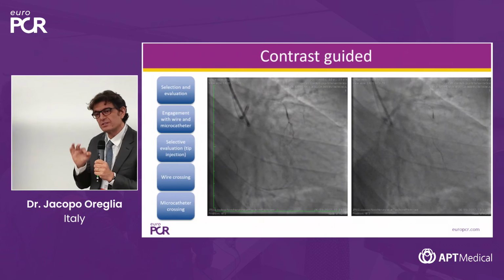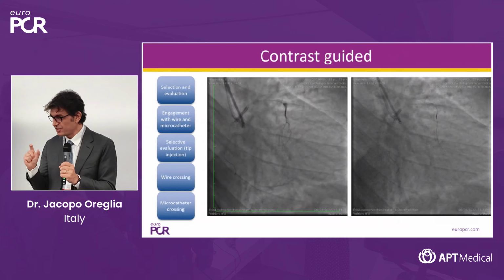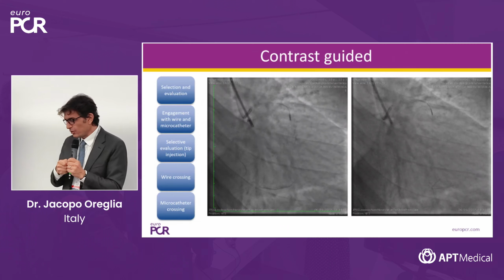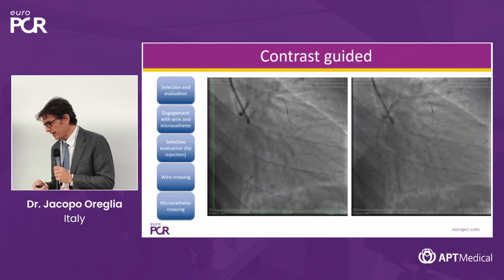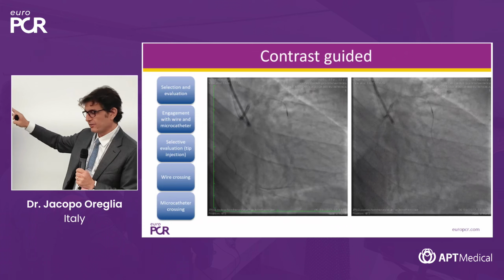One tip is also to have a good backflow on the syringe. So one of the most difficult things to find in a cath lab is the good Luer lock 2.5 syringe to do the tip injection, because it must be very robust. But you also always have to try to have a good backflow in order to avoid possible complications.